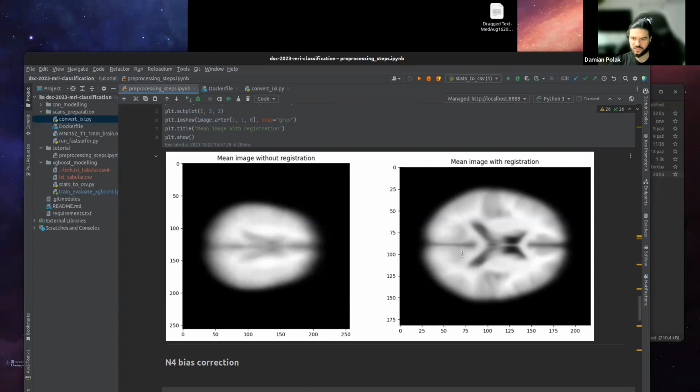From a modeling perspective, using convolutional networks, registration is necessary mostly to remove the margins here, because those pixels, those voxels are redundant, are not useful for our task. And by removing them, by cropping the margins, we can simplify and speed up our training process.